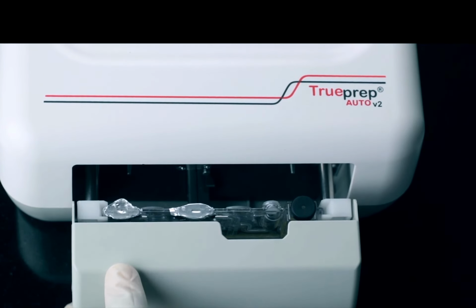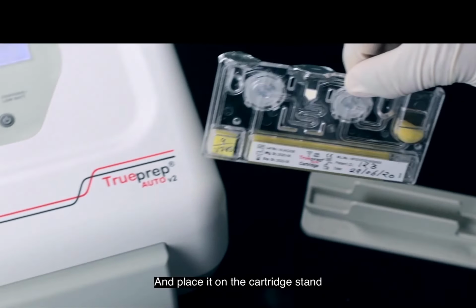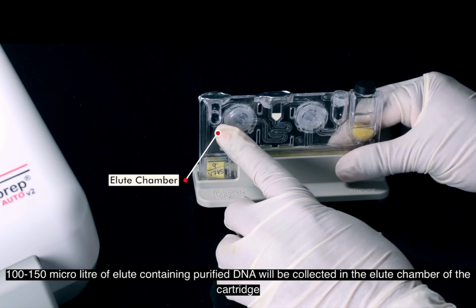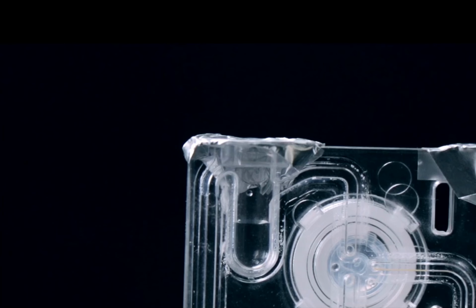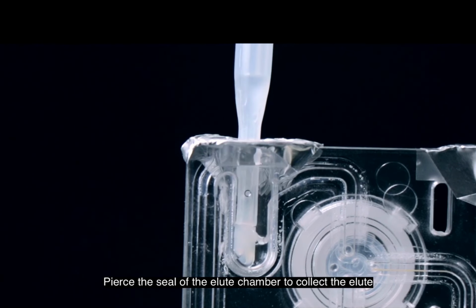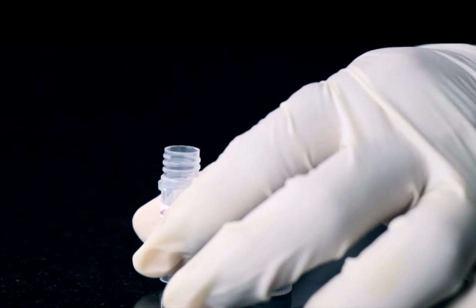So slowly pull it and take the cartridge, place it in the stand. So here you can see the elute has collected. Okay, here the elute chamber elute has collected. Purified DNA is present in this particular area, around 100 to 150 microliter. Now your elute tube is ready, open it. Then with that pipette, you have to pierce it. So you can see that is slightly slanted. So pierce it. Here also, please press the pipette and then lower. Don't go inside and press and introduce air bubbles. So you transfer all the contents into this elute tube.